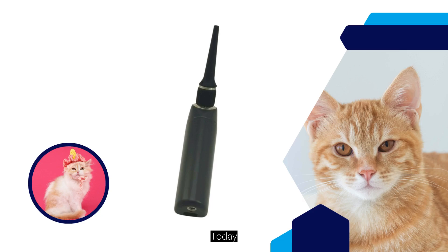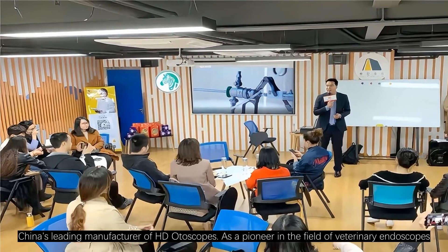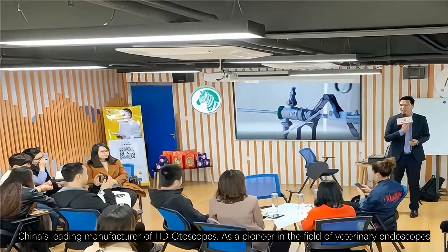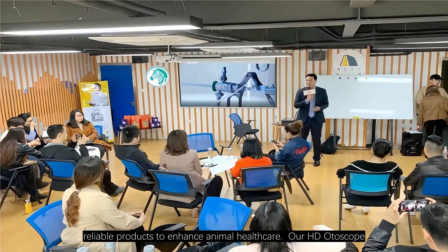Hello and welcome. Today, we're thrilled to introduce you to Rescope Co. Ltd., China's leading manufacturer of HD otoscopes. As a pioneer in the field of veterinary endoscopes, we're committed to delivering high-quality, reliable products to enhance animal health care.